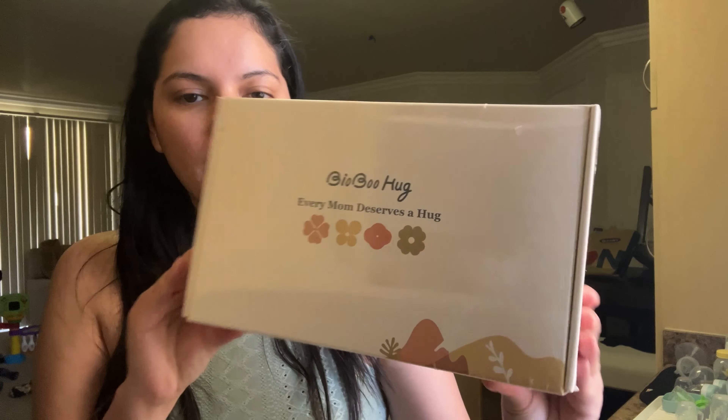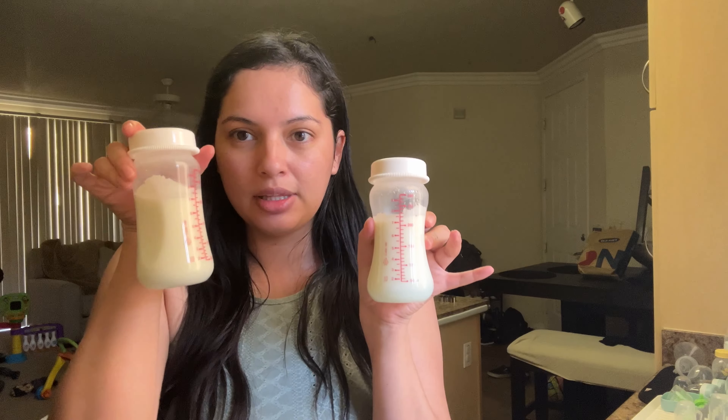So this is the box — the BioBoo Hug pump. I noticed on TikTok they always do their morning pump session, but I don't want to do a morning pump session because I already know that in my morning pumps I used my Spectra with the adapters and the correct flange size and I got about 14 ounces. I'm basically only pumping one time a day now, so I'm going to pump later in about five hours because my right breast still feels full.